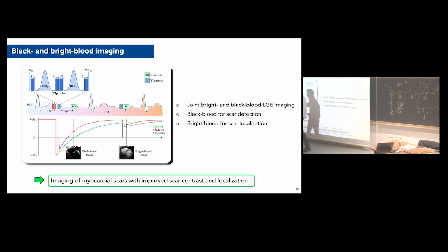So we tried it, and many people tried it in different labs, and we realized that by adding another preparation pulse, at this inversion time, now we have the signal of the blood, which is the green signal that is also at 0, which is exactly what we want. At 0 means we won't receive any signal. These will be dark pixels, black pixels. And that's what you get in theory, based on the Bloch equations.